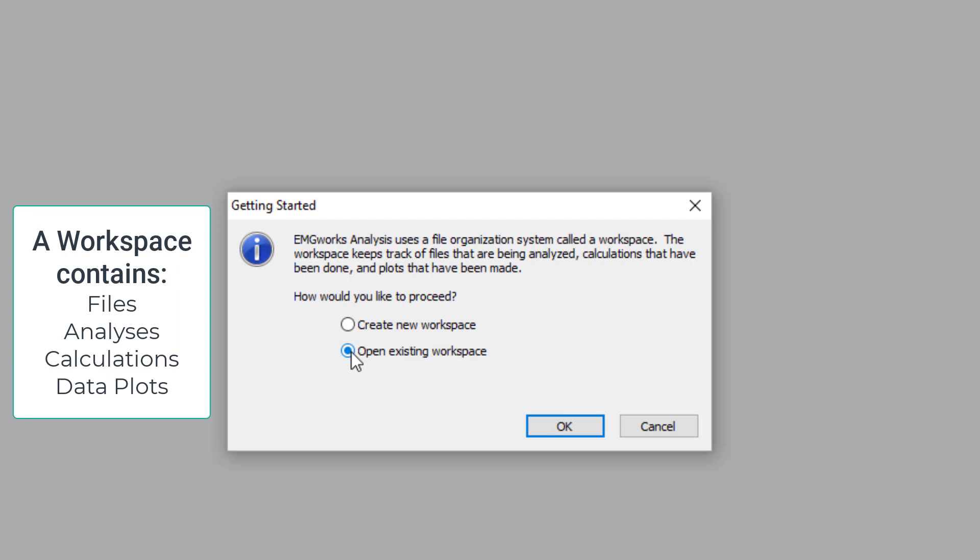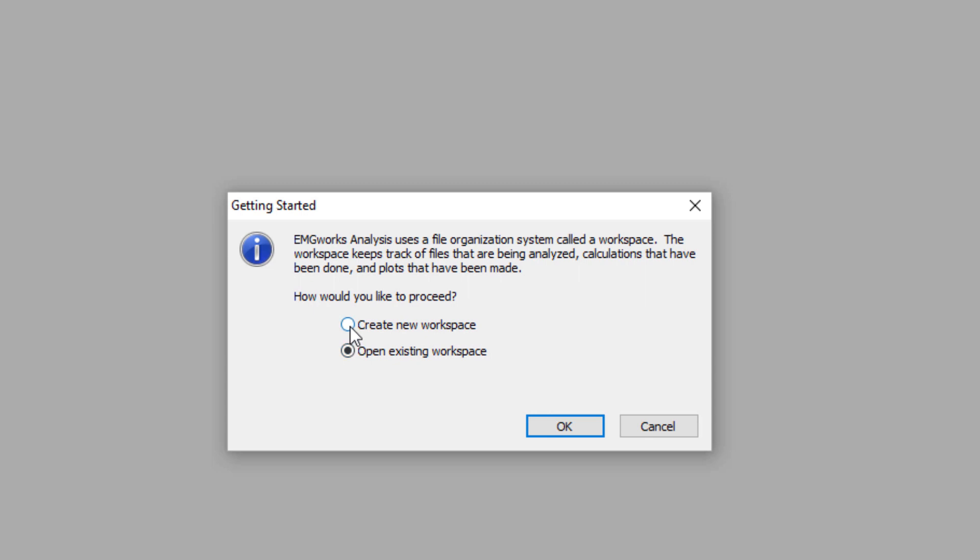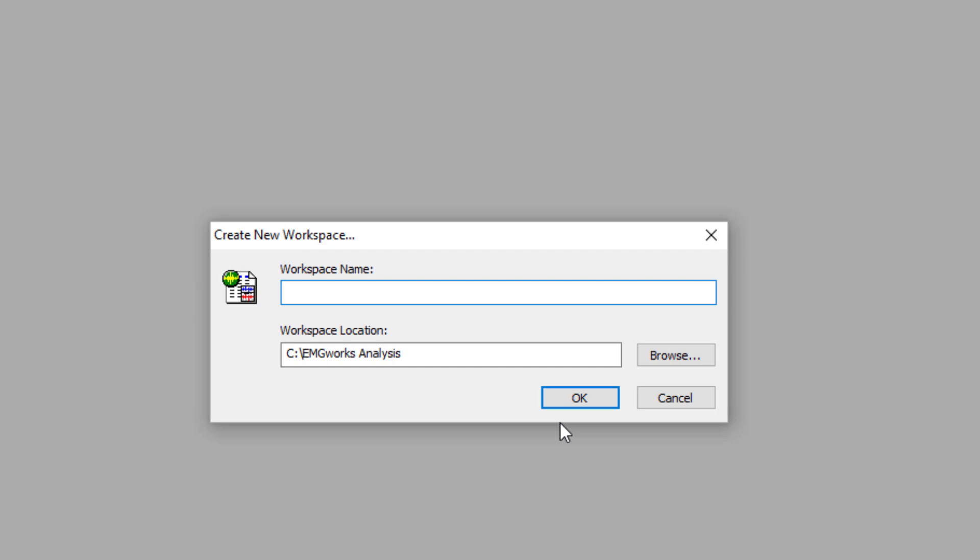Select either Create New Workspace or Open an Existing Workspace. A workspace contains the files that are being analyzed and the calculations and plots that will be made. By selecting the Create New Workspace option, this will open the Create New Workspace dialog box.